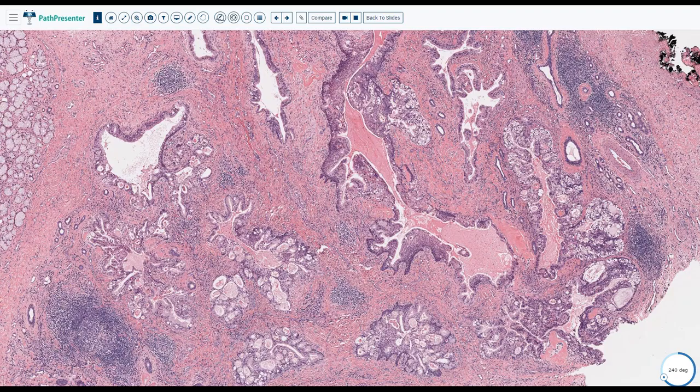But canalicular adenoma. The other thing is the mucocele. Good job. The mucocele, especially in fine needle aspiration, and we get a lot of these. And there is retention mucocele and extravasation mucocele. If you see a mucocele or a mucin secreting tumor or lesion, that's what we're going to call it, mucin secreting lesion, and say that low grade mucoepidermoid carcinoma cannot be excluded. Okay, and you have to be careful.